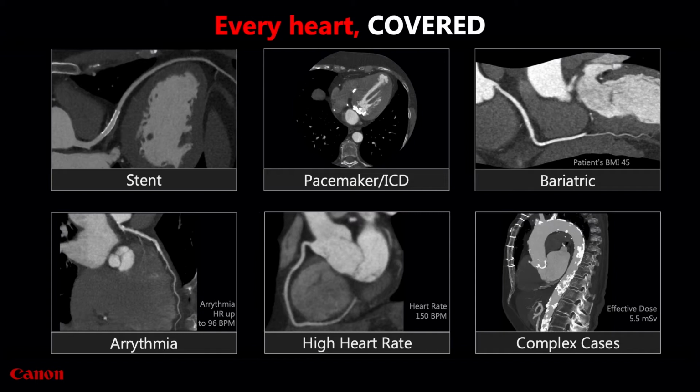And you should expect the ability to scan multiple vascular territories to plan complex interventional procedures like TAVI or TAVR, where gating is needed through the heart and not through the abdominal aorta and femoral arteries. These patients often have impaired renal function, therefore it's important to reduce the contrast volume as much as possible. The minimum radiation dose should always be delivered.